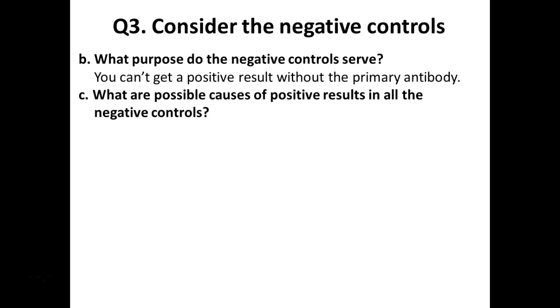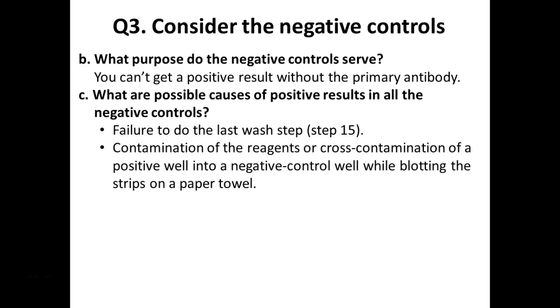What would cause a positive result in our negative controls? Cross-contamination, right? Failure to wash out stuff, right? If you didn't wash out the antibody and we put the next one in. Contamination, I'm going to show you guys how to do that so you don't contaminate.